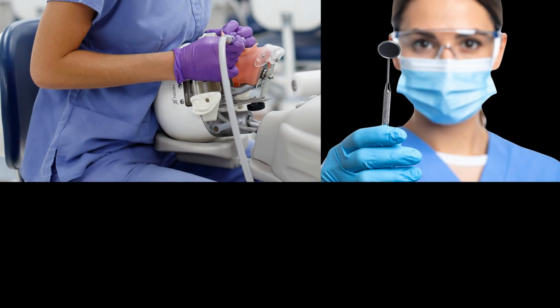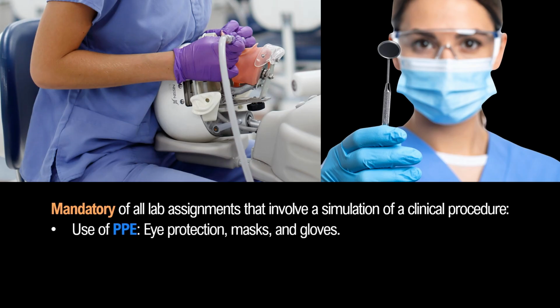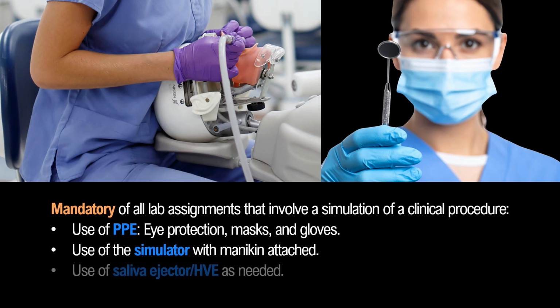One thing you have to remember is that for all of the lab assignments, which are a simulation of a clinical procedure, you'll need to have your PPE on. So that means your eye protection, masks, and gloves. You'll also need to be providing that clinical procedure on the simulator with your mannequin attached. And as needed, you may need your saliva ejector or HVE.